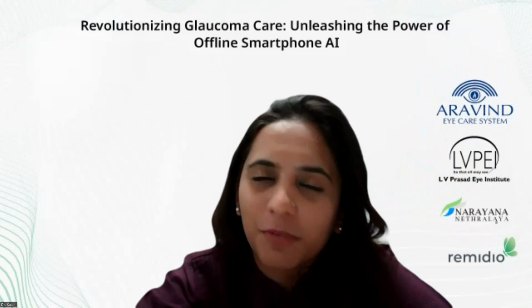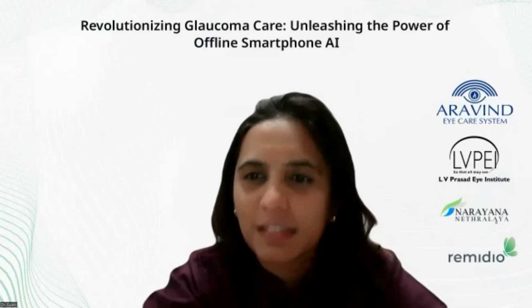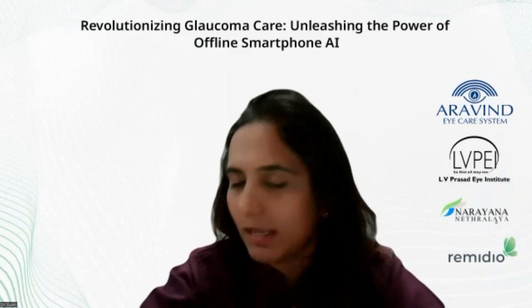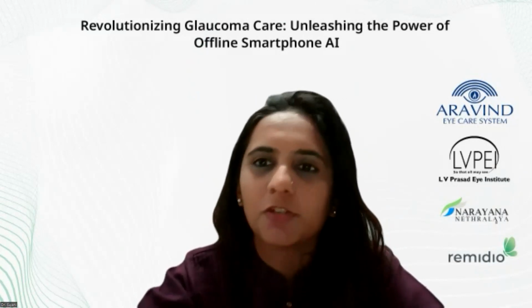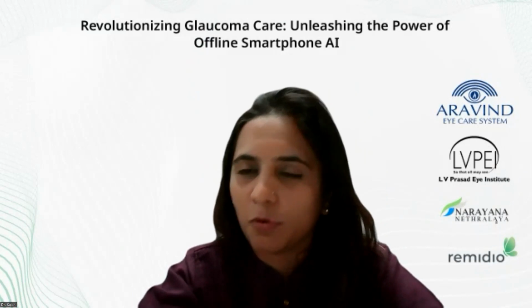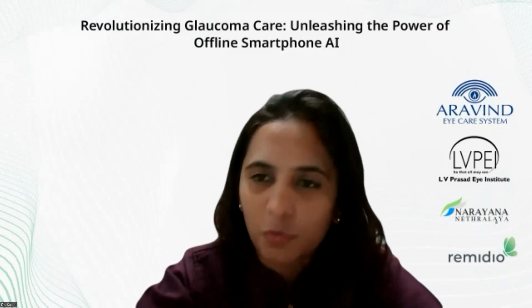Yes, sorry. So definitely we can't do away with visual fields and OCT, because just like how visual fields and OCT are investigation modalities, AI is just helping you with investigation and managing the patient. You can't do away with visual fields and OCT because those are the standards, until AI reaches that stage where we can actually quantify the changes and progression to the extent that visual fields and OCT are doing.